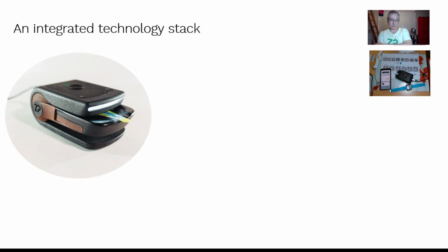stroke patients. When they enter the emergency room, they're screening them on purine, because I think when you have a stroke, you can have what's called stroke mimics, and you can have people who are generally having stroke. A stroke mimic could be somebody who's actually drunk, but a genuine stroke could be purines. They think maybe one of the biosensors for that. So purines is on the platform. Testosterone they're also interested in, nitrate they're also interested in, and pH are also interested in.